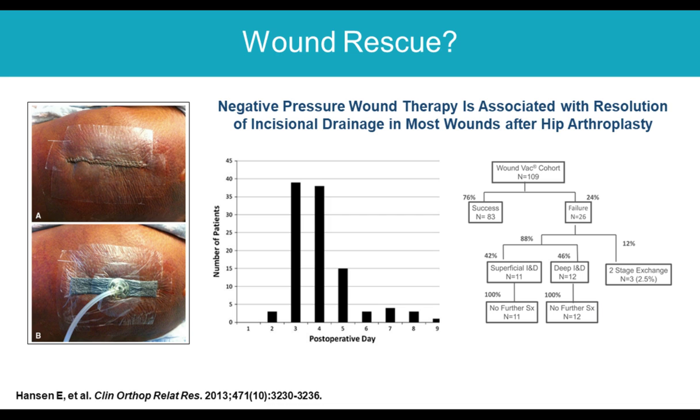And the study that supports this is from the Rothman Clinic in Philadelphia, published in 2013, showing that when they did this in patients on day 3 or day 4 or day 5, most commonly, they were able to resolve incisional drainage without problems about 75% of the time.